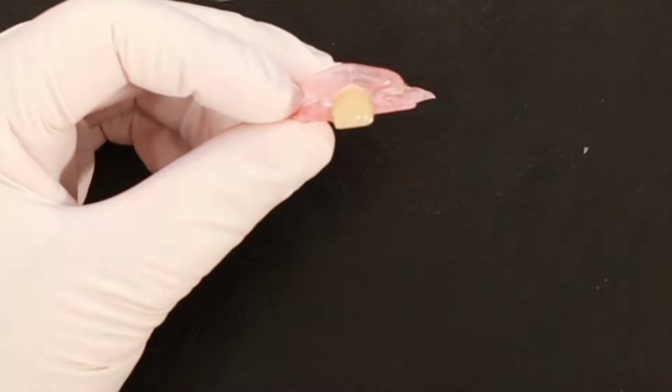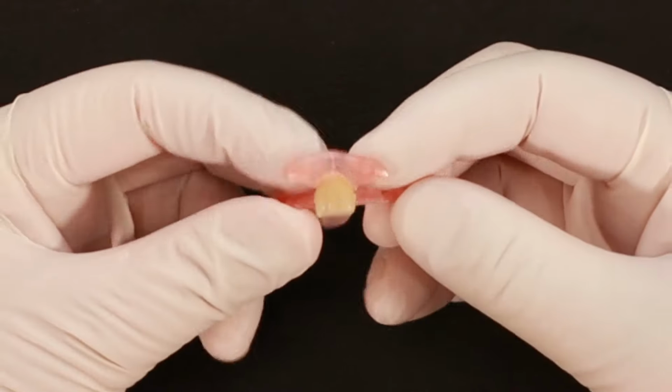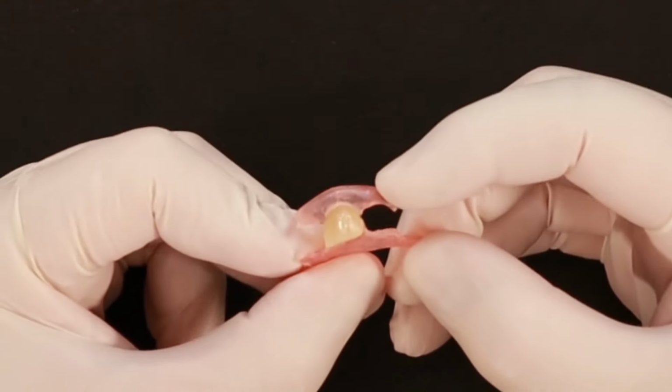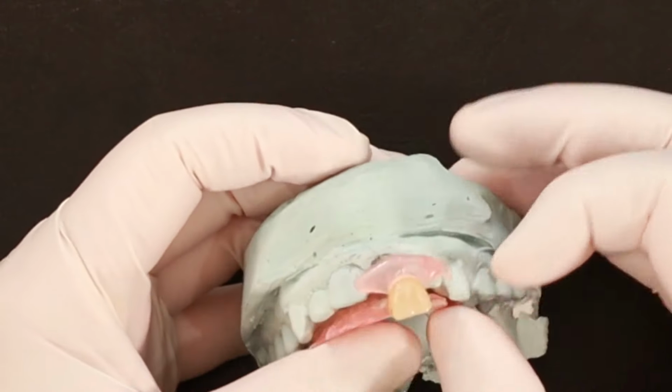Thanks to newer plastics, new designs of flippers can be used for both looks and eating. These types of flippers are made out of a flexible nylon. It is made with clasps, and due to the flexibility of the nylon material, the clasp can grip the teeth on either side of the space. It can achieve a nice snug fit and stay in place very well.